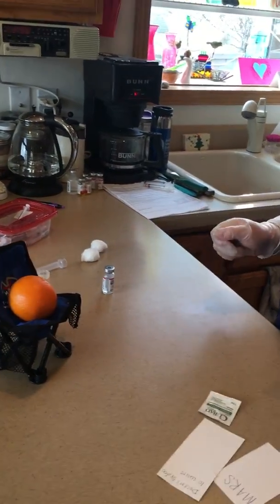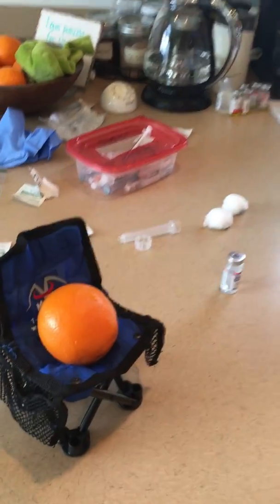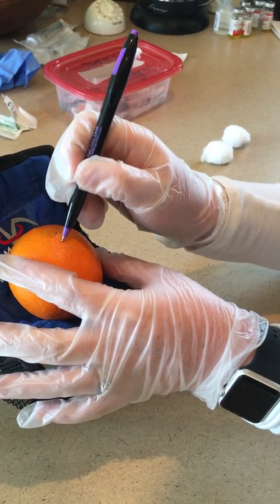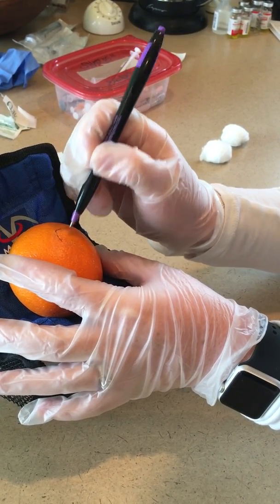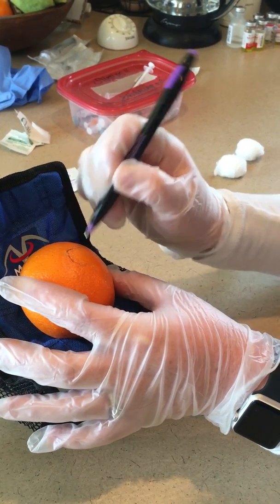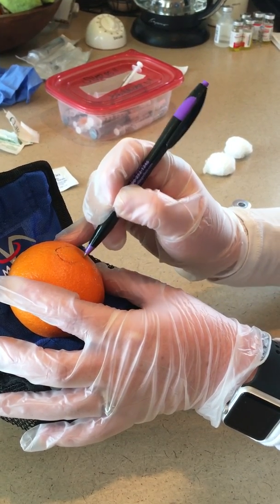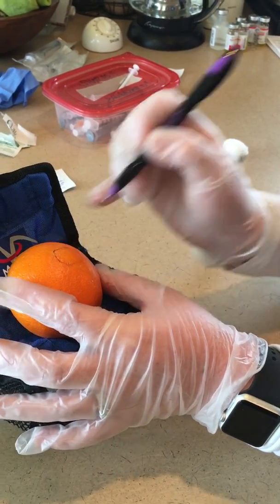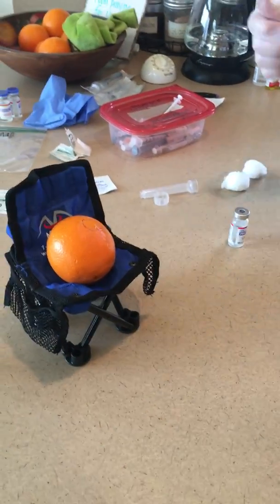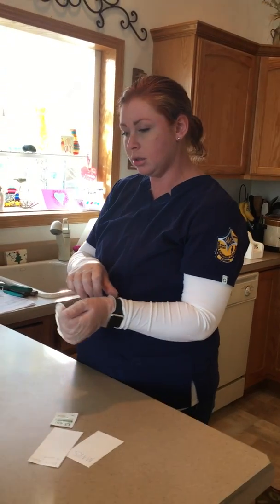Then I'm going to draw a little circle around here so that when you come back in 48 hours, we can assess. My pen's not working very good. Anyway, I draw a little mark there around the wheal so that when you come back in 48 hours, we can assess your reaction to this test.